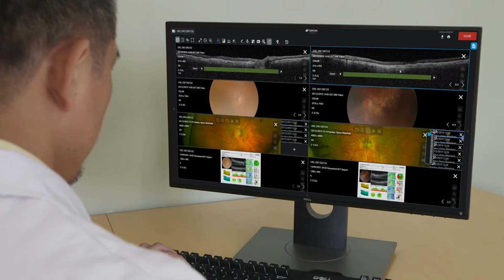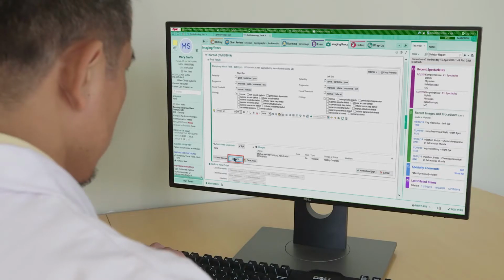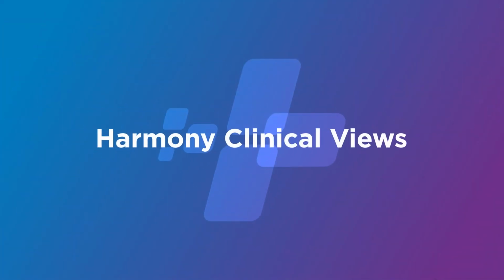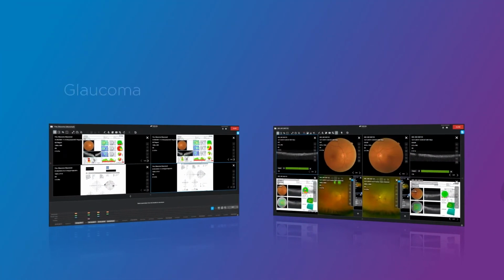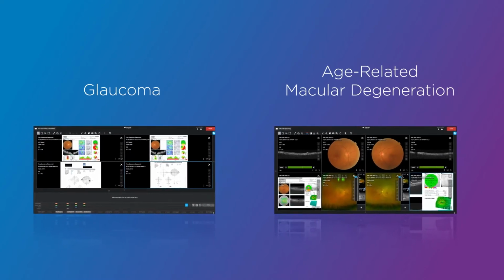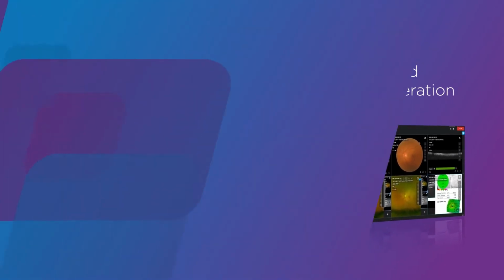From the patient's chart in your EMR, Harmony can be launched with one click. Login is done automatically to expedite access. Harmony provides a complete picture of the patient's eye health on a single screen. The clinical views can be easily customized by disease entity, so you can see only the information needed to make a diagnosis or treatment decision.